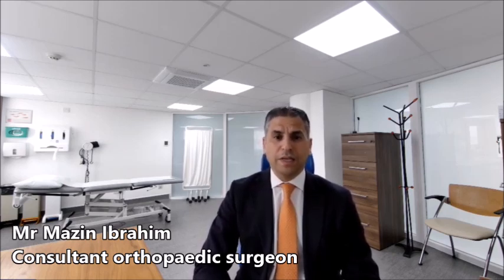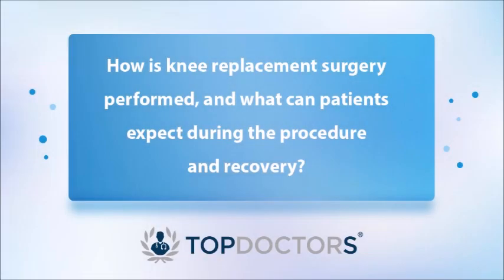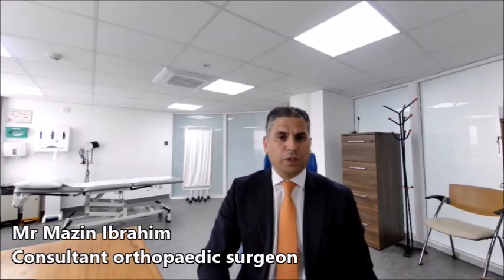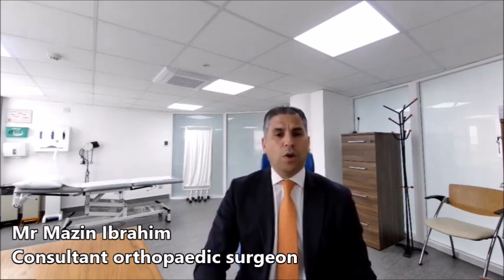Knee replacement itself can be partial or full knee replacement. It can also be conventional knee replacement or a robotic assisted operation. I do most of my knee replacements robotically assisted, and this is one way of doing it. As I mentioned before, this can be partial or full knee replacement.